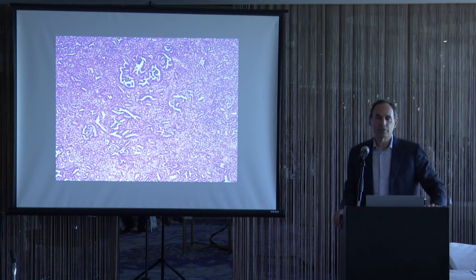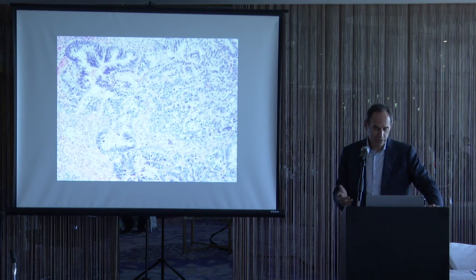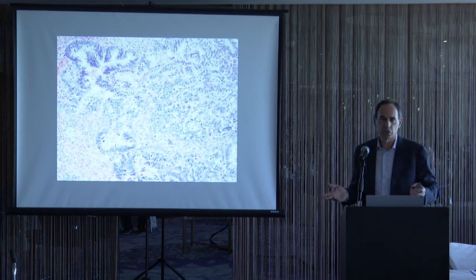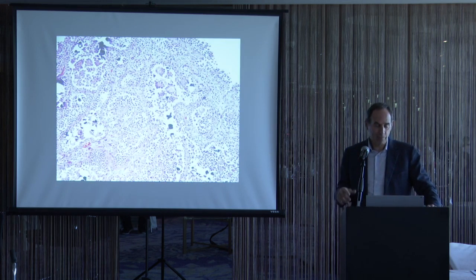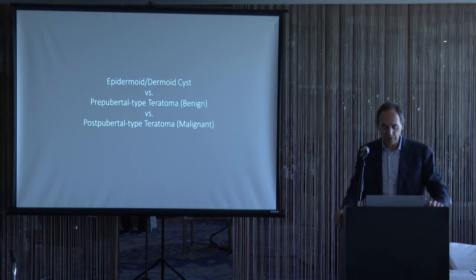Another common type of somatic malignancy is the embryonic type tumors. For example, this is a case of a Wilms tumor arising in a teratoma. One could see neuroblastomas arising in a teratoma. This is an example of an adenocarcinoma arising in a teratoma, where this is sheeted out greater than a 4x field. This was a case of a papillary carcinoma that sheeted out greater than a 4x field, somatic malignancy arising in a teratoma.